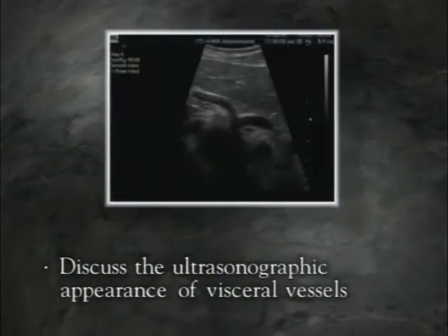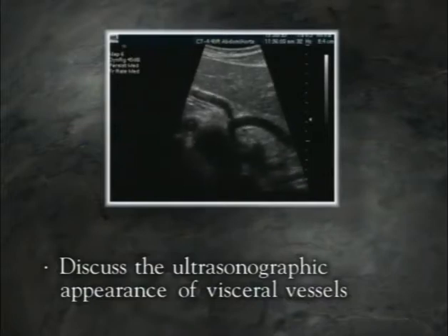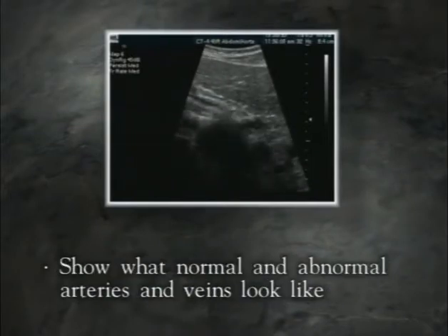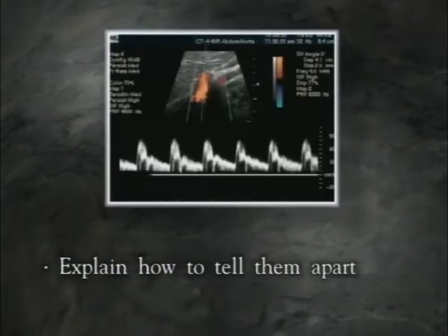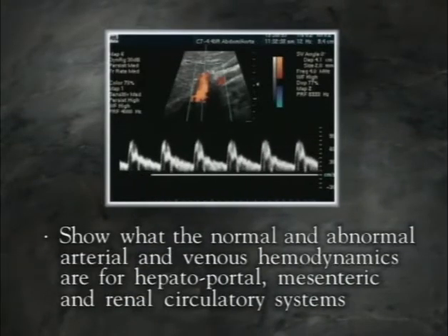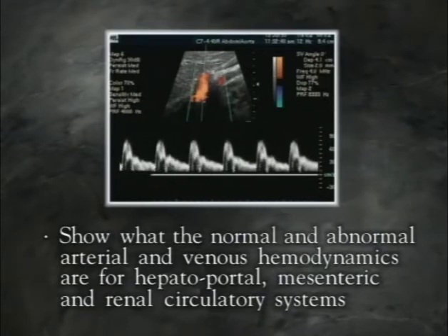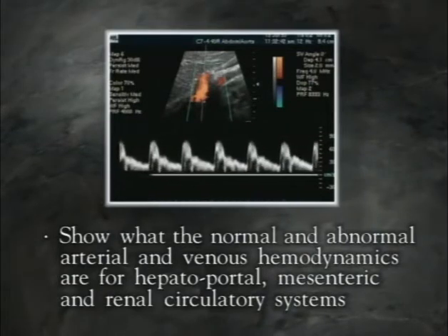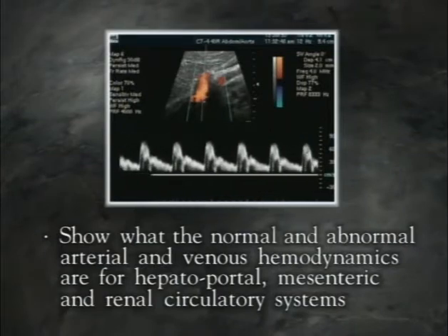Using this model, we will demonstrate the external and internal landmarks that the technologist might use to complete an examination. We'll discuss the ultrasonographic appearance of the visceral vessels — what do the normal arteries and veins look like on the screen, and how do we tell them apart? We'll also cover the normal and abnormal arterial and venous hemodynamics for the hepatoportal, mesenteric, and renal circulatory systems.